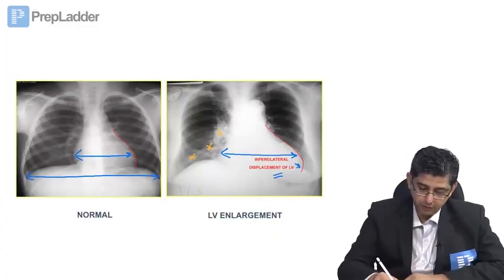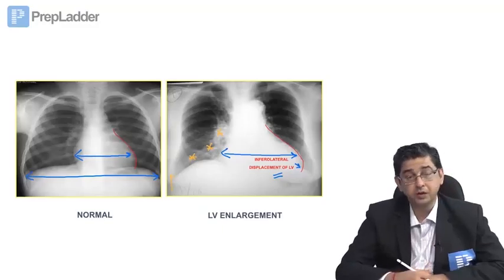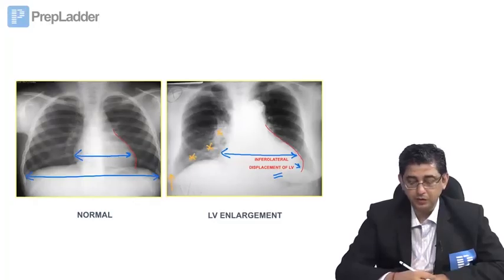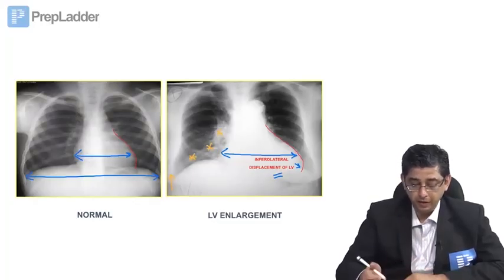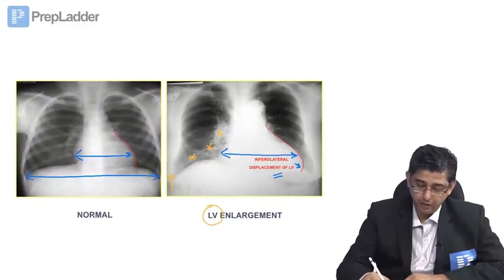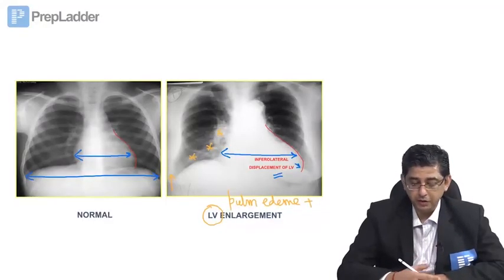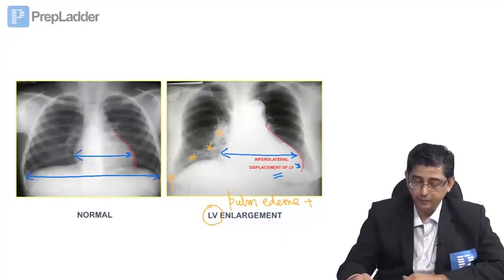There is also some evidence of minimal pleural effusion present in the patient. So considering the image showing an increase in cardiothoracic ratio and perihilar infiltrates, it is suggestive of left ventricular enlargement, and the image also shows evidence of pulmonary edema. So this goes in sync with the fact that the left ventricle of the patient is enlarged, and this image shows a left ventricular enlargement.